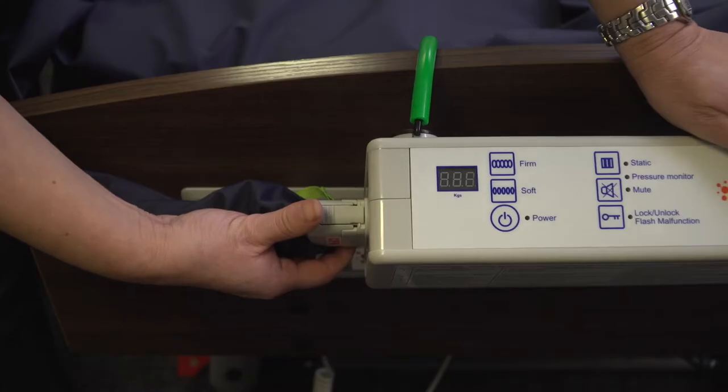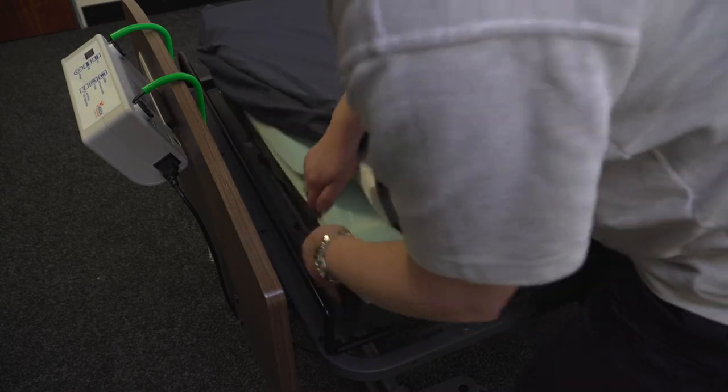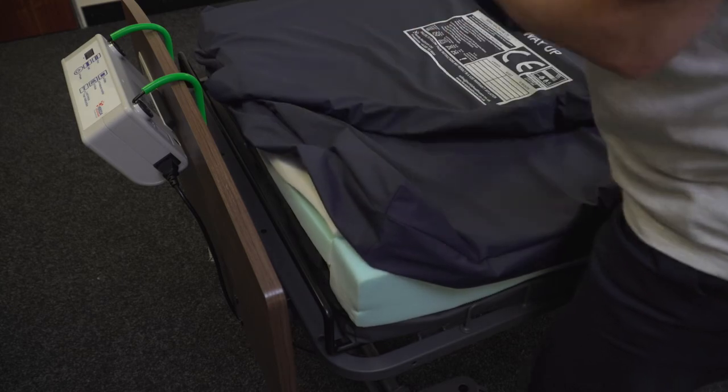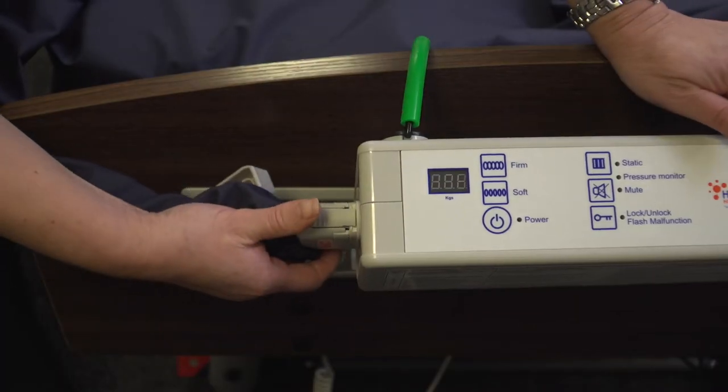The Herida Moray Combo has a unique CPR function where there is no requirement to frantically search for the CPR function in an emergency. Simply detach the mattress from the pump and commence CPR. Due to the nature of the foam-filled cells under low pressure, CPR can also be administered while inflated. To convert the static mattress back to a dynamic system, remove the tube set connector from the foot of the mattress and connect it to the pump.